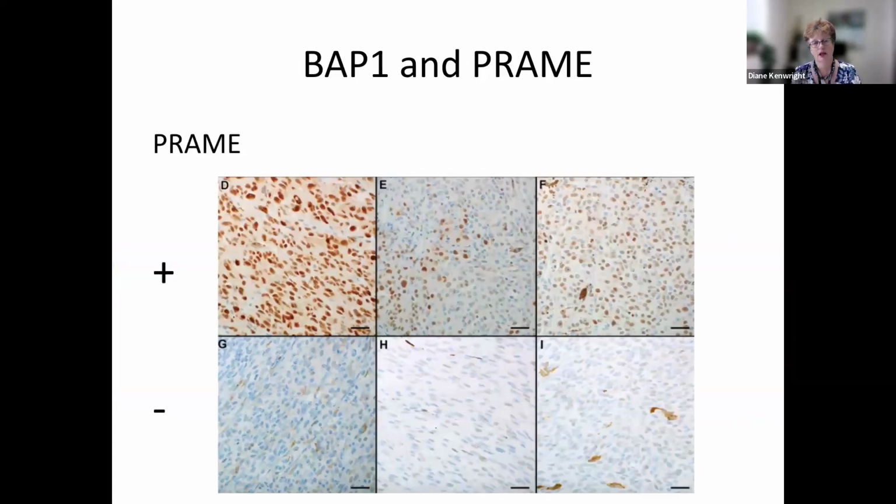Yep. So PRAME, right? So this is PRAME. PRAME here is expressed abnormally, and it's in various degrees. So there can be some PRAME staining or no PRAME staining. So these are all negative, and this is various degrees of positive. So for the pathologists in the chat, you can score PRAME like you score ER, but even a low degree of expression is positive.